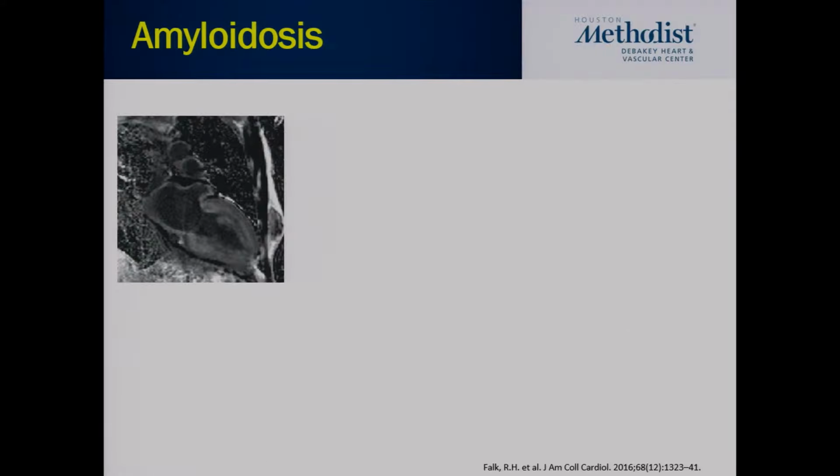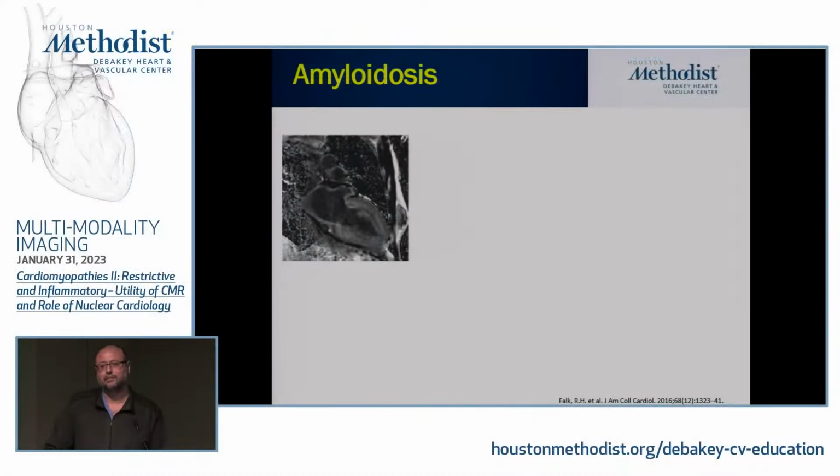So let me quickly switch to amyloid. Again, for amyloid, we come after a good echo or a good CMR, where the patient should have a clinical suspicion for this and imaging supporting it. Now the role of PYP imaging, which is done by SPECT, not by PET, is really to differentiate the different types. So we're not making the diagnosis. A patient could still have amyloid and have a negative PYP. So we are coming after you have done a great echo.